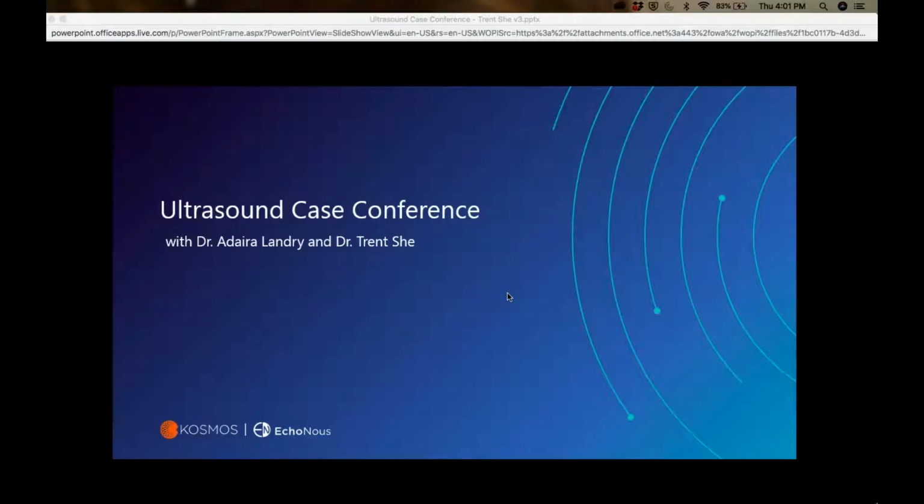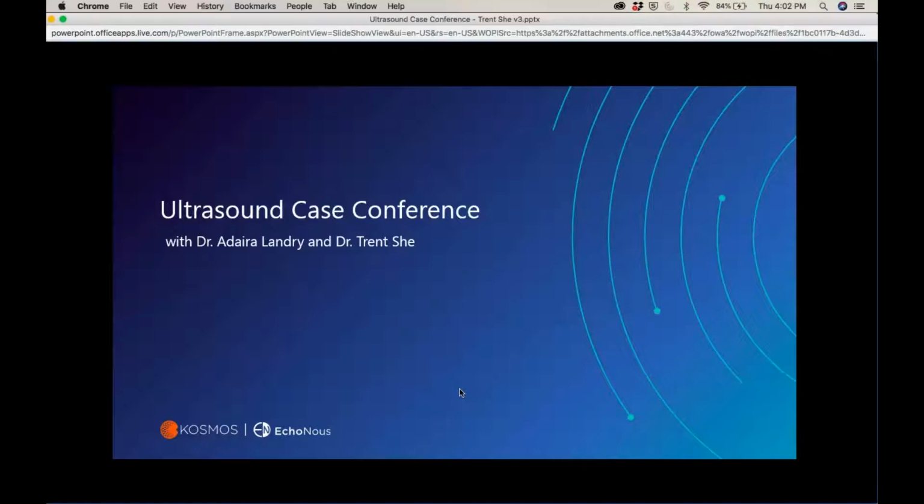So why don't we just go ahead and jump right in? We have three really awesome cases today prepared by Trent. He's going to be talking to us about the interpretation of these images, a little bit about how we can optimize them, and a little bit about the patient care as well. So it'll be quite interesting. So let's go ahead and jump right in.